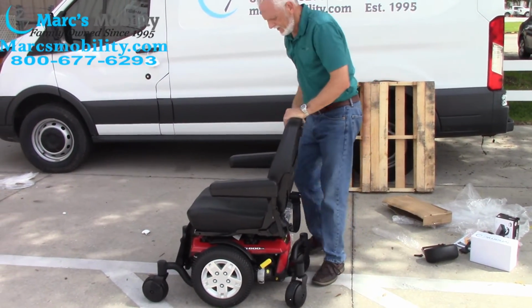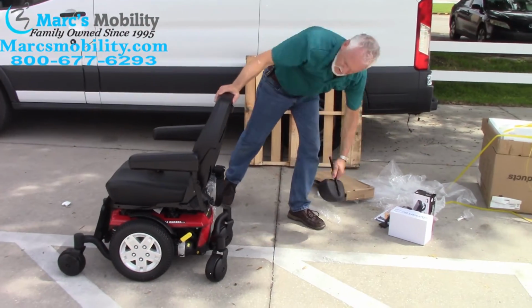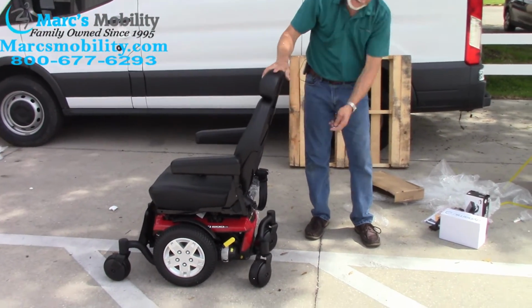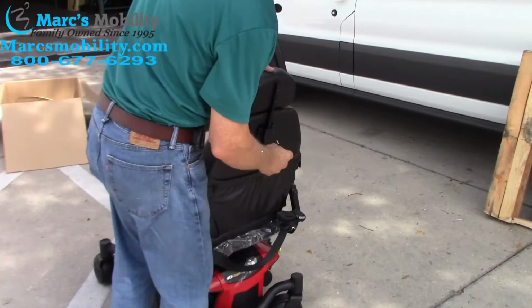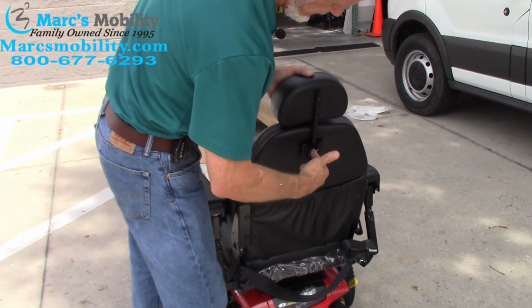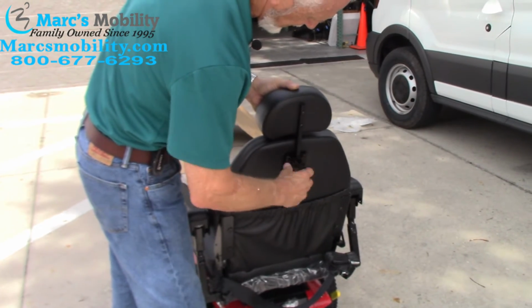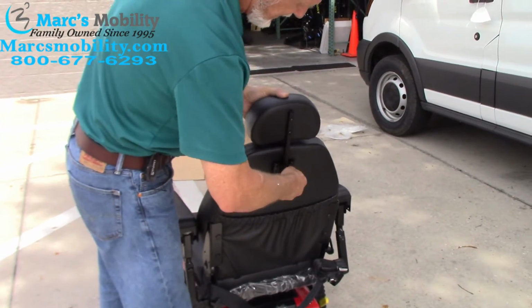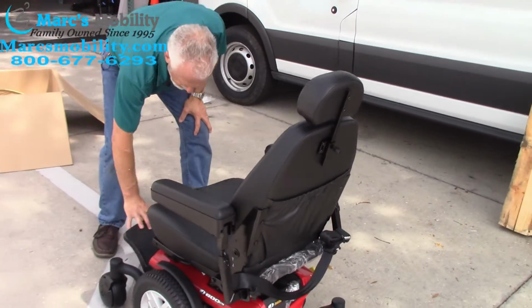All right, so I'm going to pull the seat back a little bit. Next thing I'm going to do, we're going to drop the headrest in. We're going to take this little screw that you did not lose. We'll put it right here, and we're going to keep turning. And then we're going to tighten it. Okay, that's your headrest.